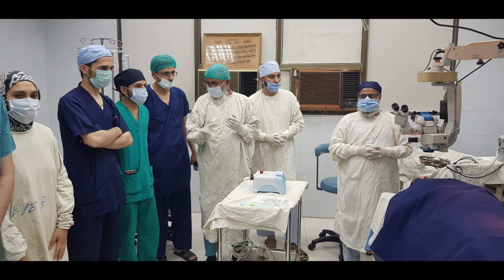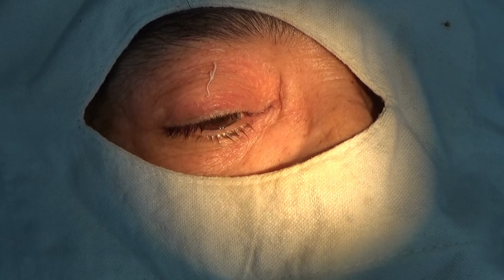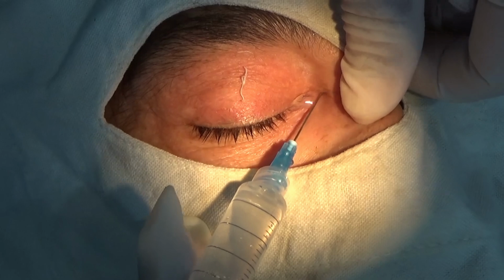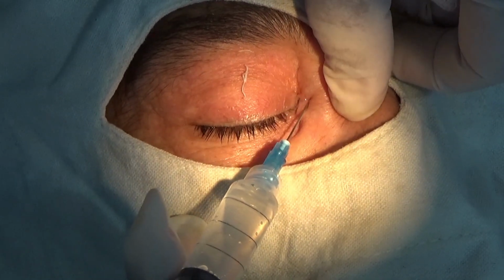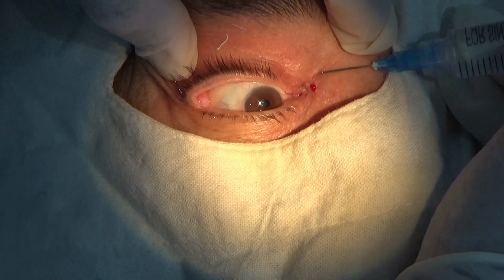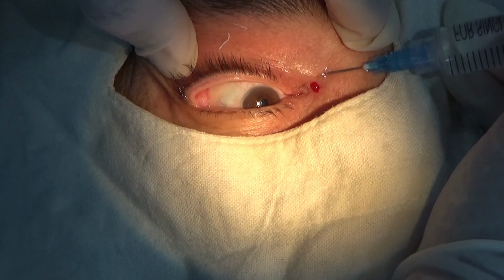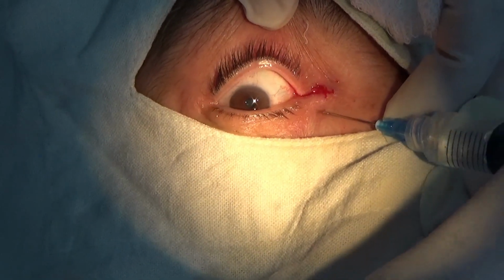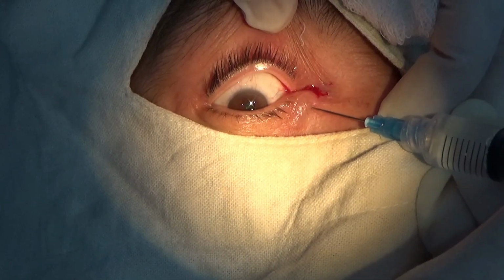In most cases, I use local anesthesia. For this, first of all, I pack the nose with swab soaked in 4% xylocaine and adrenaline. Then I inject 2% xylocaine with adrenaline on side of the nose, 1 centimeter in front of the medial canthus above the upper canaliculus and below the lower canaliculus.